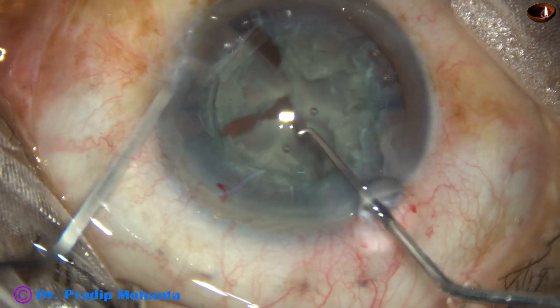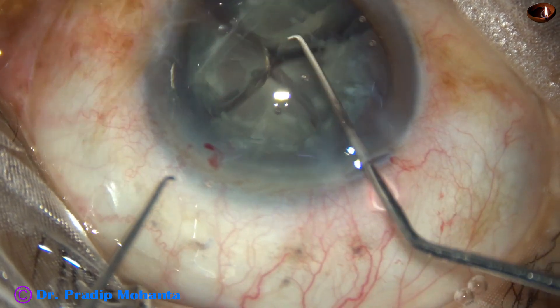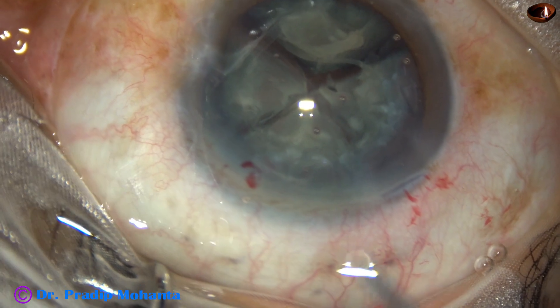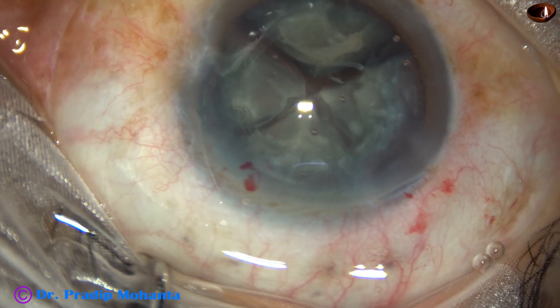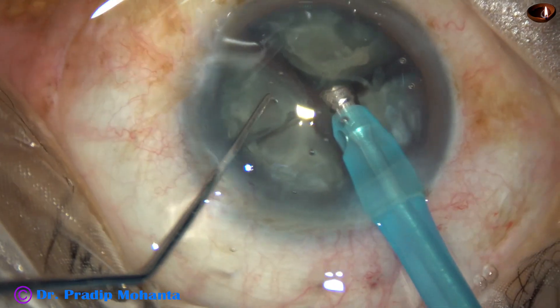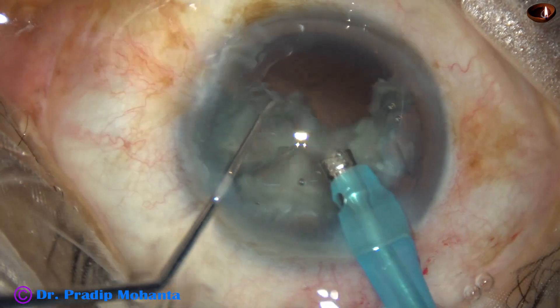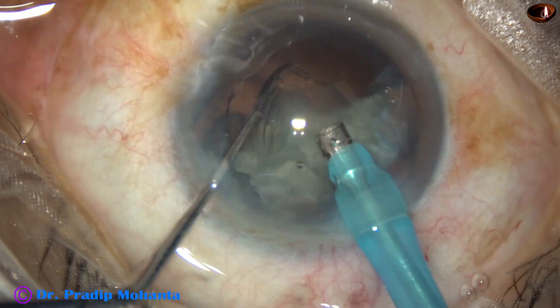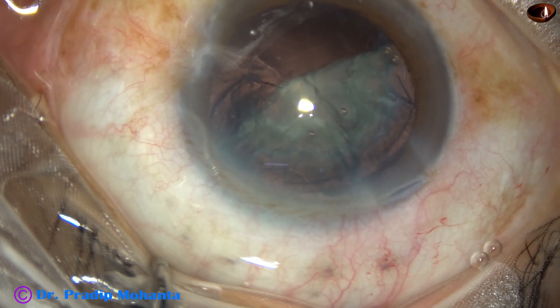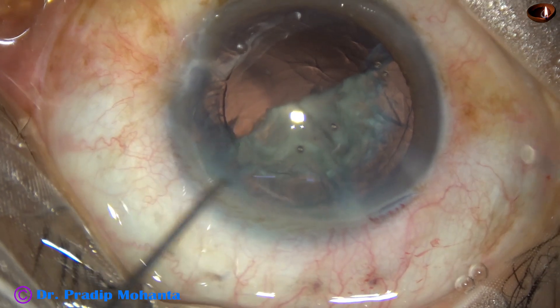Crack and separate. And now tilt and bring the apex out of the capsular bag, with the pieces projecting into the anterior chamber. Inject visco and introduce the phaco needle again. For emulsification and removal of the quadrants, the ultrasonic energy is the same — about 60%. Flow rate is 40 and vacuum is 400. With this machine, beginners can use lower vacuum and lower flow rate, but with lower vacuum and lower flow rate, it is slower emulsification and followability is less. When the flow rate is less, followability of the pieces is less.